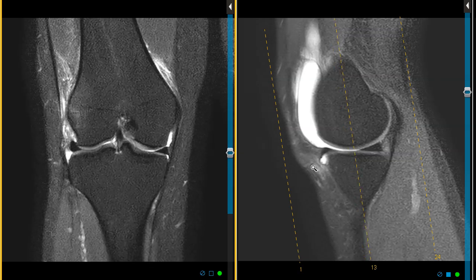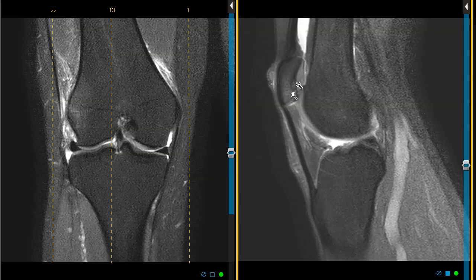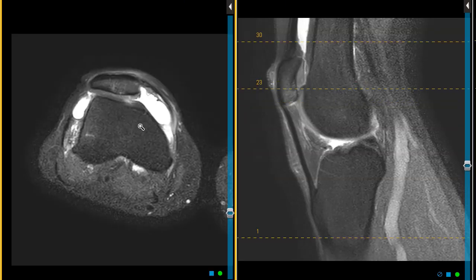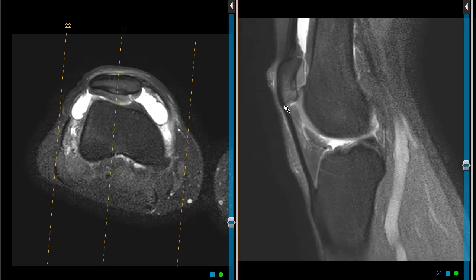No ACL tear. Now we're going to look in the front of the knee. This is her kneecap, her patella. This is her finding — she has a problem in her patellofemoral compartment. Her patellar tendon that comes off the kneecap down to the tibia is too long. This is developmentally elongated, causing the patella to be high-riding and unstable. We call this patella alta.